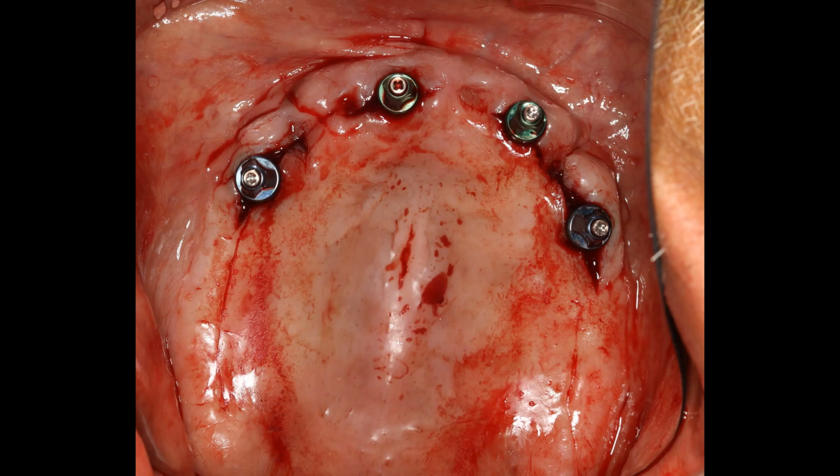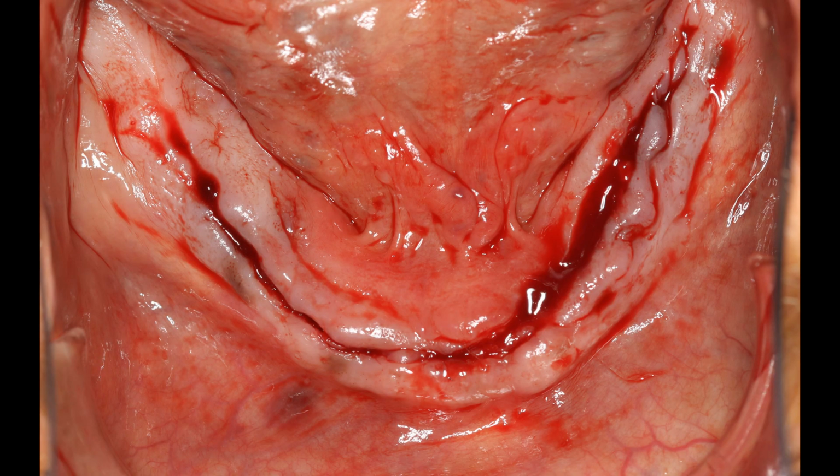This is the mirror view of the same shot of the impression copings on the implants 2 months after the initial surgery. This is the mirror view of the lower jaw at the time of uncovering 2 months after the first surgery. And you'll notice that where I've got abundant keratinized tissue, I will simply make my incision right through the center of it. But in any place that I have limited keratinized tissue, I will make my incision towards the palate or towards the tongue so that I have plenty of keratinized tissue to put on the outside of the implants. It's a very important finesse point about implant surgery that a lot of doctors simply don't know about or care about.